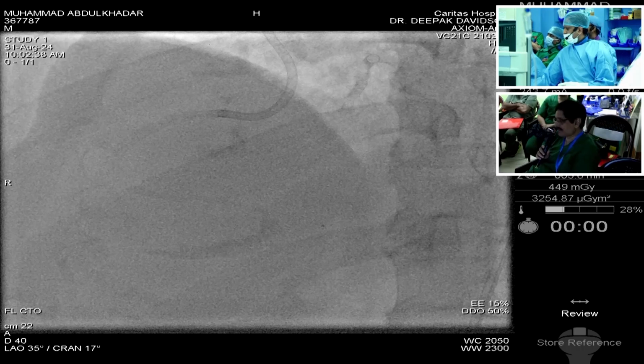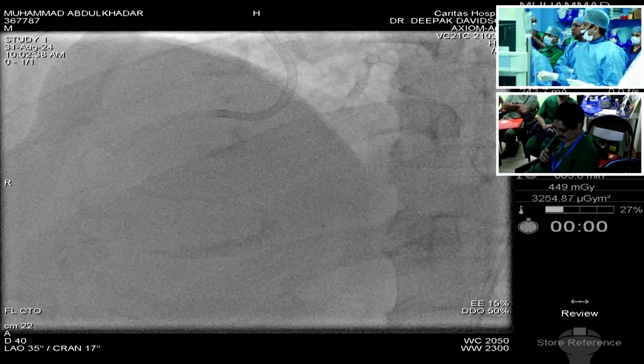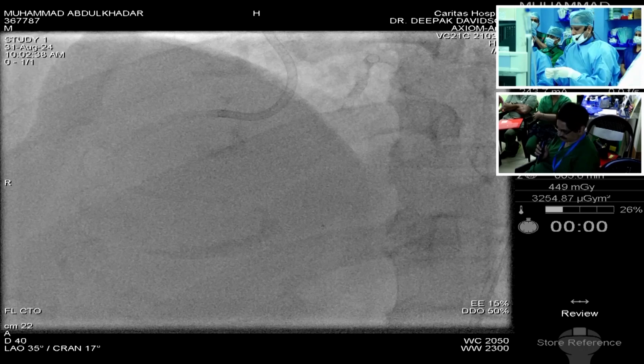We are next seeing the microcatheter exchange with the wiper wire, seeing the amount of calcification there. Probably you would want to have the temporary pacemaker inside, right? Because we expect some sort of slow flow during the procedure. Definitely, as the calcific lesion length is longer and longer, there may be more chances of no flow or slow flow phenomena, unlike focal calcific lesions.